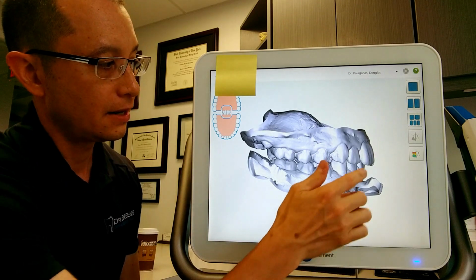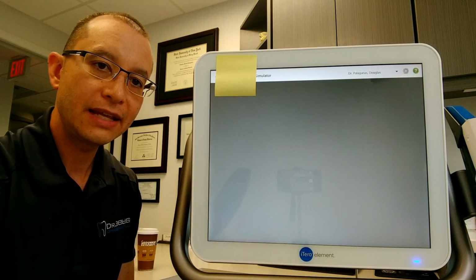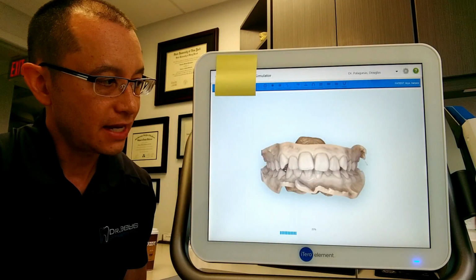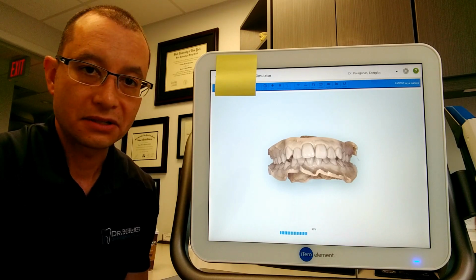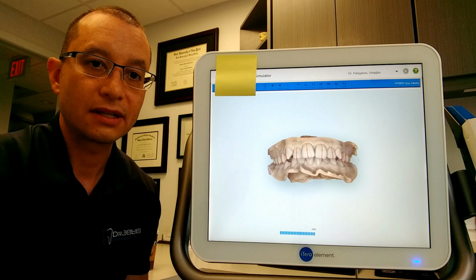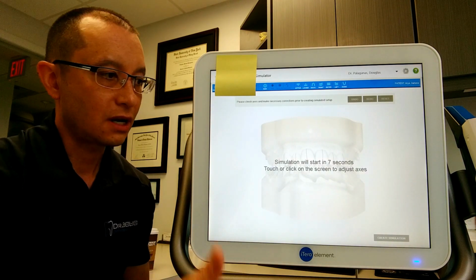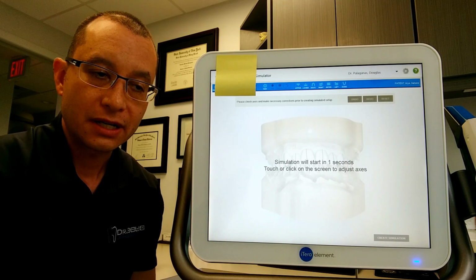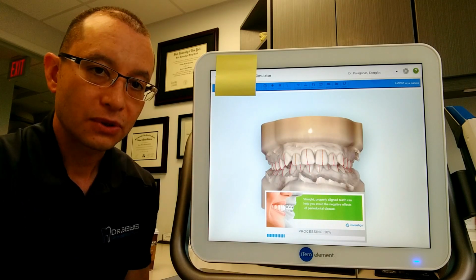or Invisalign. So what I'd like to do right now is take you into something called the outcome simulator. And what our iTero scanner is really doing right now is taking the current condition of the patient's teeth, and the alignment and the bite situation, and it's actually going to start moving things around. It's going to start recalibrating where the teeth sit and the alignment of them. And the really neat thing is that within a couple minutes, what you're seeing happen right in front of you, we can run a simulation, which is fairly accurate, and give you an idea of what your teeth would look like or what your child's teeth would look like at the conclusion of orthodontic treatment.